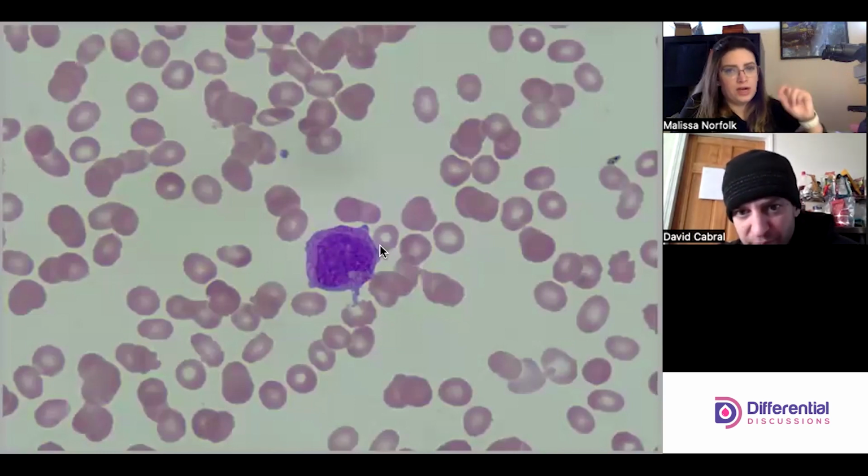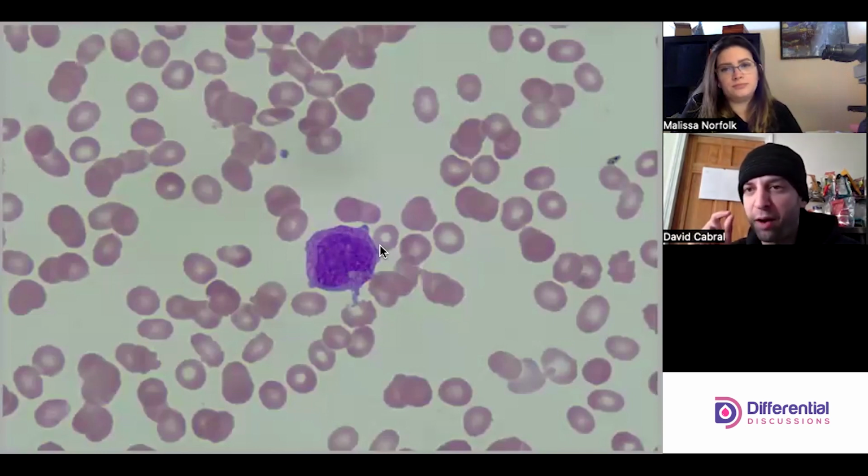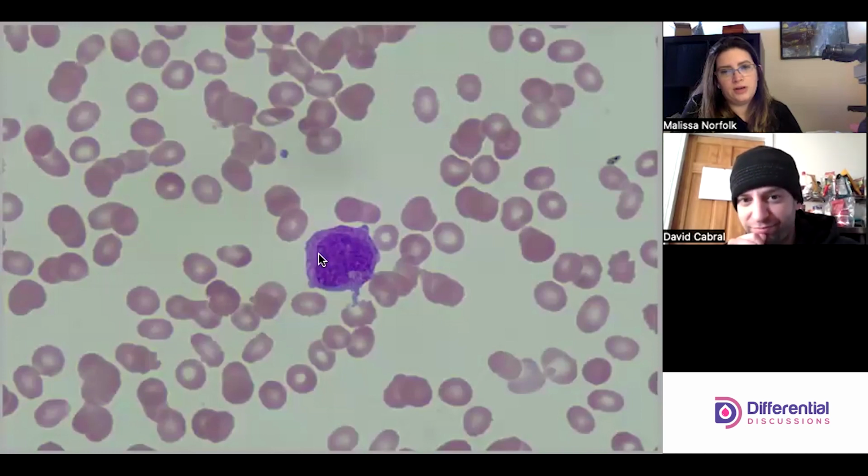You don't see the granules distinctly, but you see a grittiness to it. So it looks like there's granulation, but we're just beyond the resolving power of the microscope, so we can't actually see them as distinct entities. And I'm seeing a nucleoli here and another one there. The nucleus looks a little bit more mature than what a promyelocyte does with the clumping in here, but it still looks like a pro.